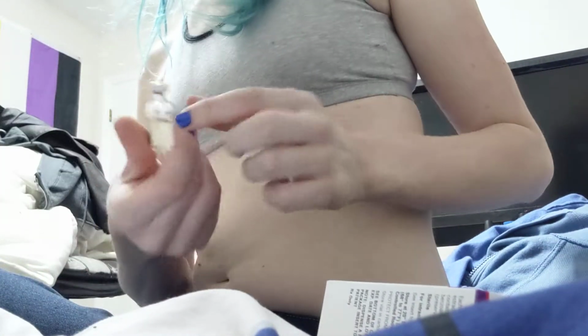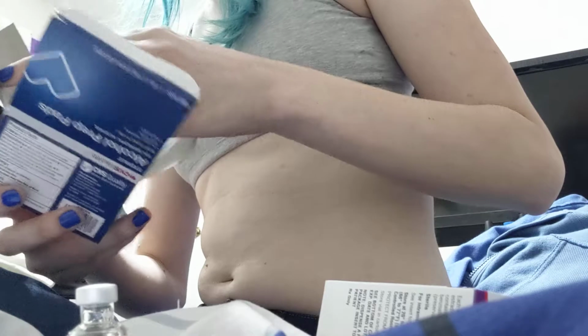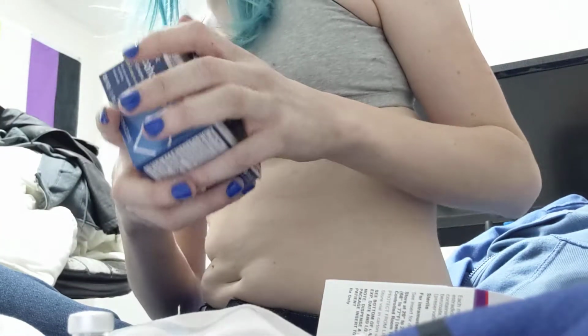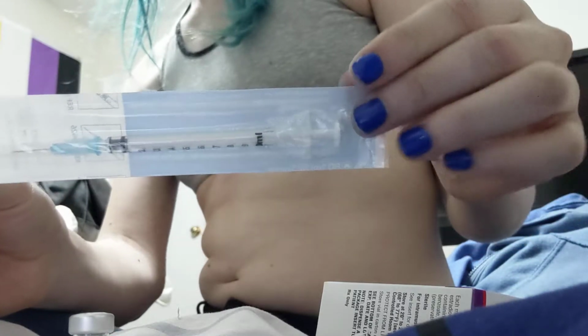Alright, I'm going to be showing how I do my Estradiol Valerate injections. A couple things I'll need. I'll need 2 alcohol prep pads, the actual vial of Estradiol Valerate itself, 2 different size needles. One of them is a syringe with a 25 gauge needle.